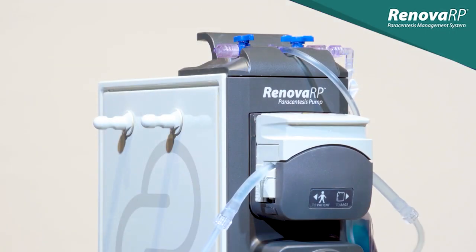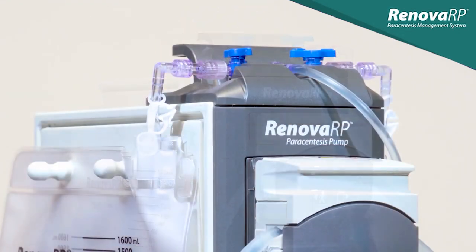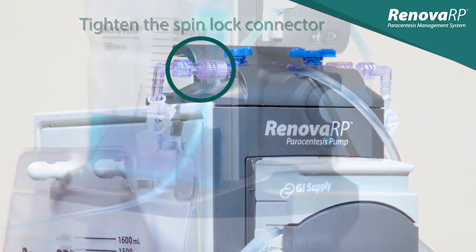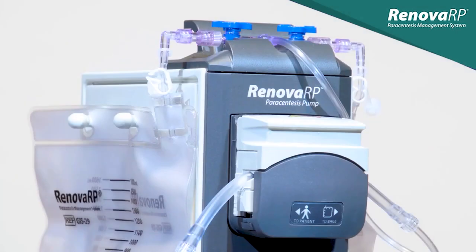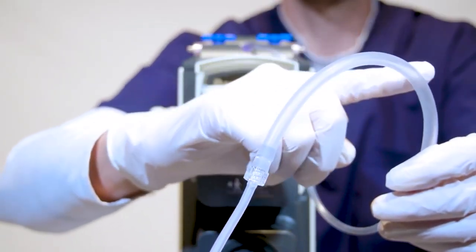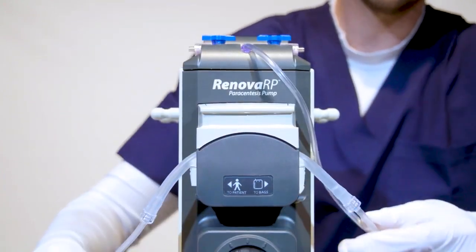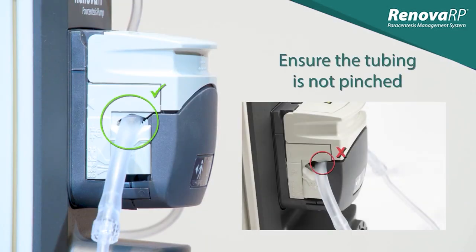Once the full bag has been removed, replace it by following the original procedure for connecting a bag. Ensure you have firmly connected the bag to the T-connector and that you have tightened the spin-lock connector. This bag change procedure is repeated until the fluid drainage is complete. If you experience a situation where the pump is running but fluid is not moving, confirm that the larger diameter tubing section is positioned properly over the pump rollers with the flip top closed. Be sure the direction of the tubing matches the visual indicator on the front of the pump head. When the flip top is closed, ensure that the tubing is centered in the track and is not pinched.